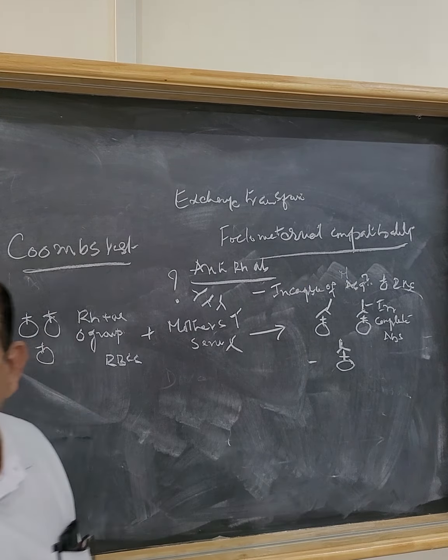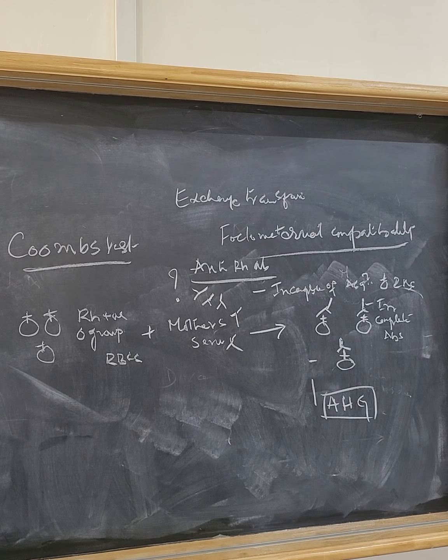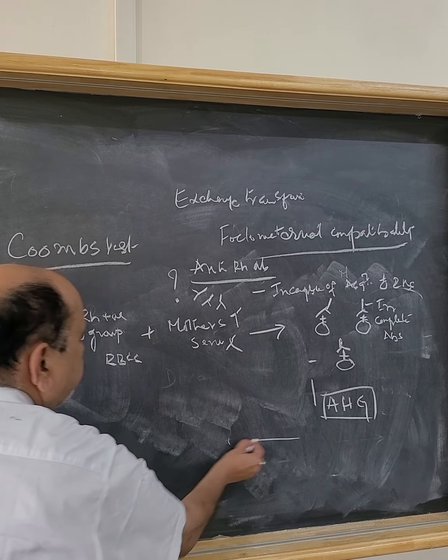Anti-human gamma globulin. Then there will be agglutination.